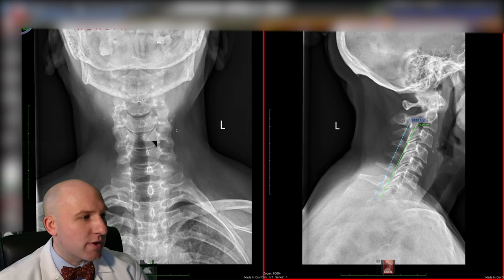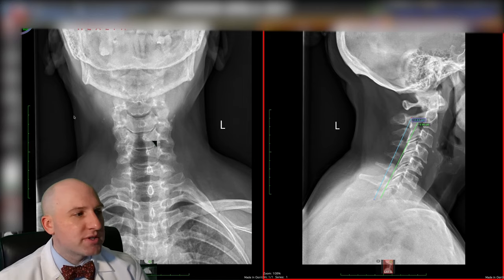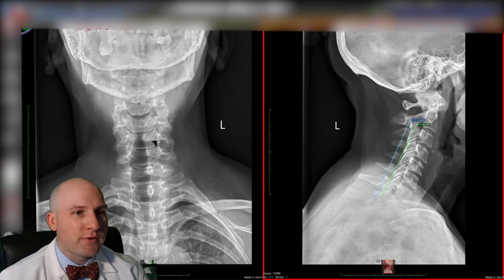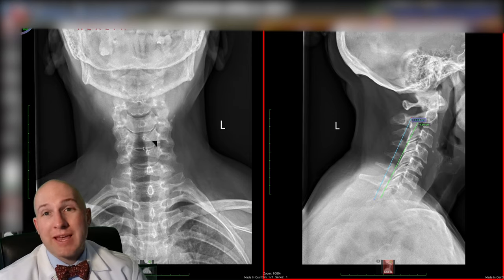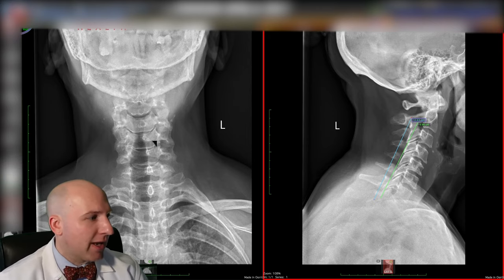So these are the x-rays. The look from the front is called an AP, anterior posterior. And this is where you can see a lot of really good information about the arthritis, the overall alignment and whether there's scoliosis. There's a lot more information to go through, but don't hesitate to ask them to get x-rays, because we can actually get a lot of information, especially about patients who are coming in just with complaints of neck or back pain, just by looking at x-rays.